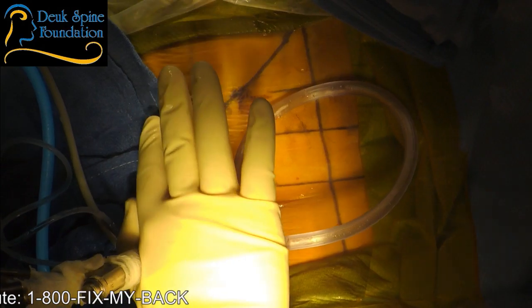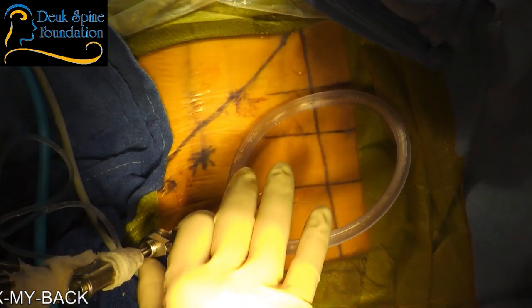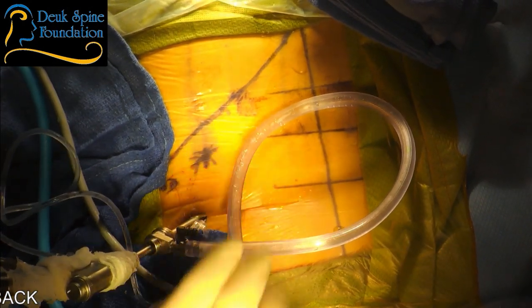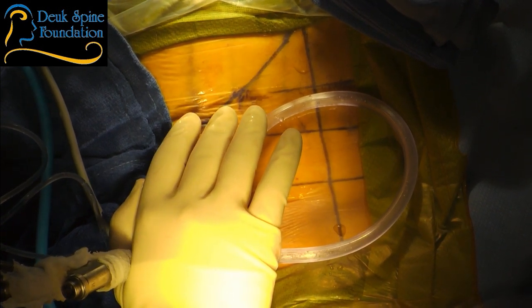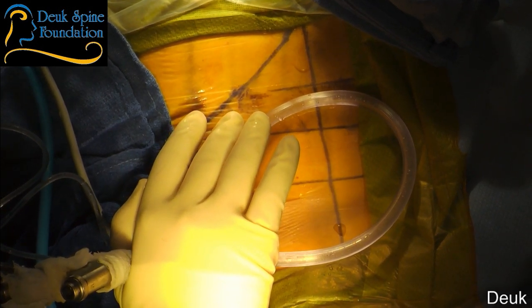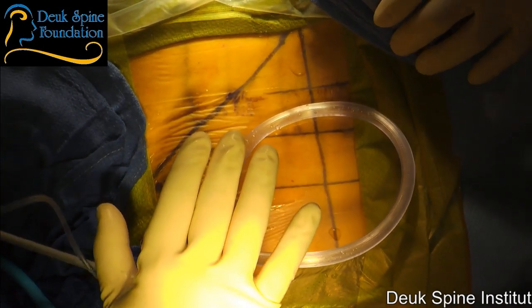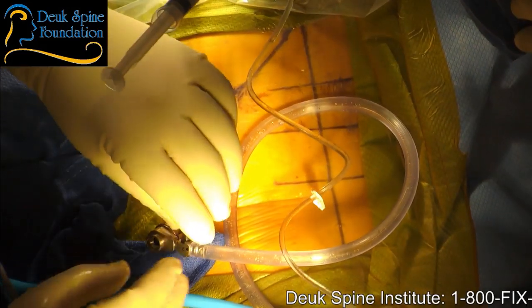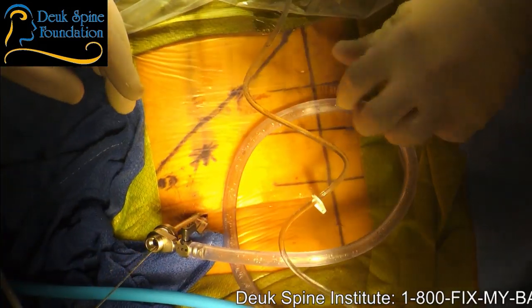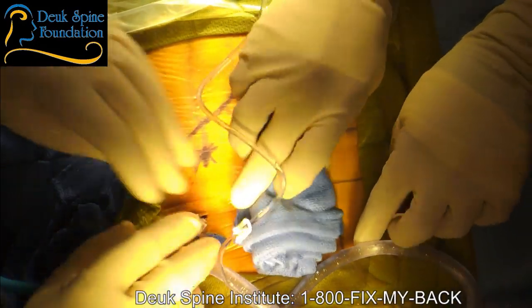Every other disc surgery done, microdiscectomies, endoscopic or microendoscopic discectomy, all of them basically require removing bone, the lamina. It's called a laminotomy, and removing part of the facet joint called a partial facetectomy. You don't want to do that because that's going to weaken the patient's spine. But every surgeon does that when they do the open spine surgeries. That's what we're avoiding here.